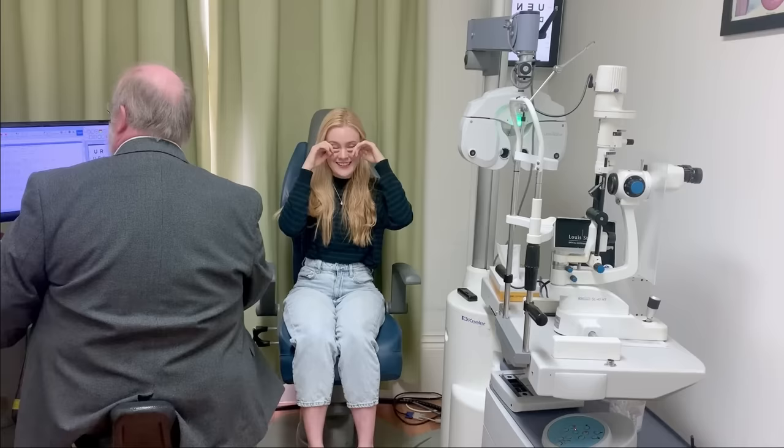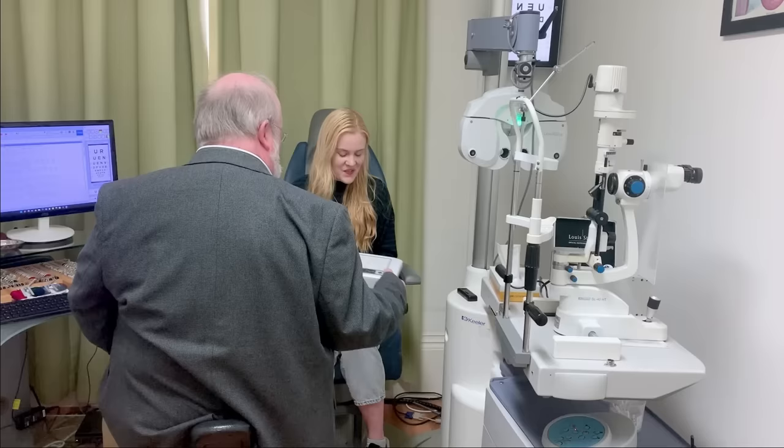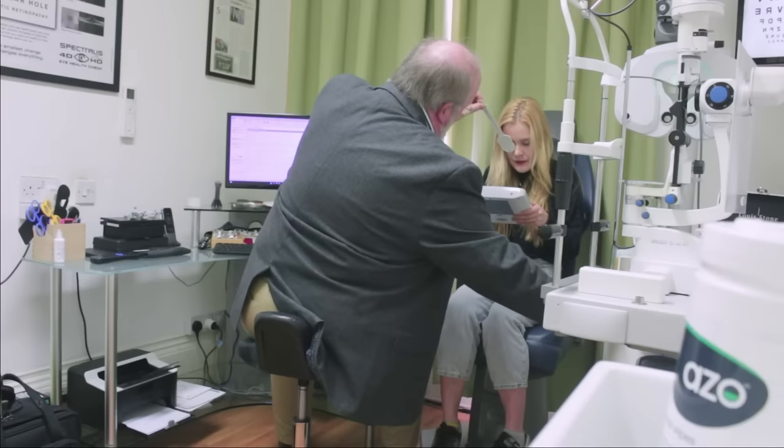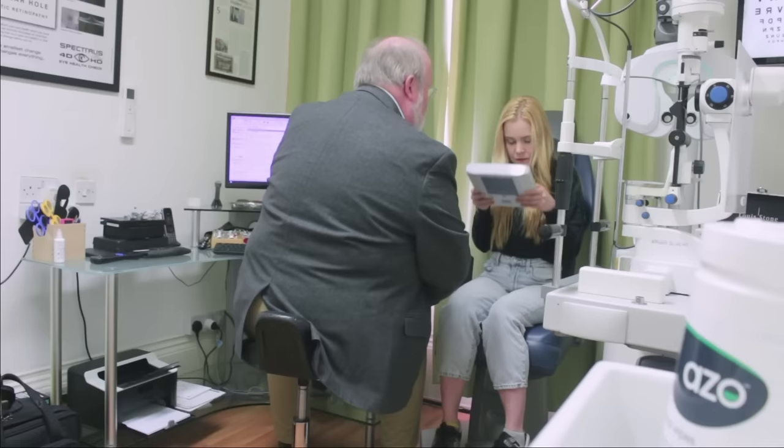That's alright. But let me give you this, and hopefully this looks a lot easier. Have a hold of that. Can you see the very small one there for me? The N5, yes. That's quite easy, is it? And if I cover that one, can you still see it there? Yeah. And can you still see it there? Yeah. Lovely. And if you move it in towards your nose, tell me when it goes smudgy. Oh, on your nose, okay. Smudgy. Well done, that's good.